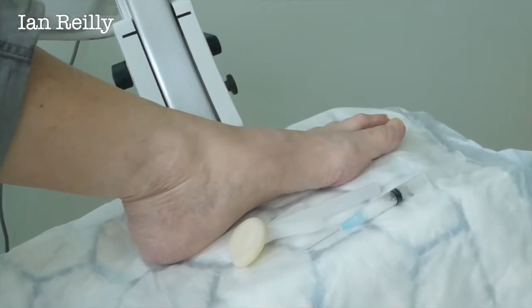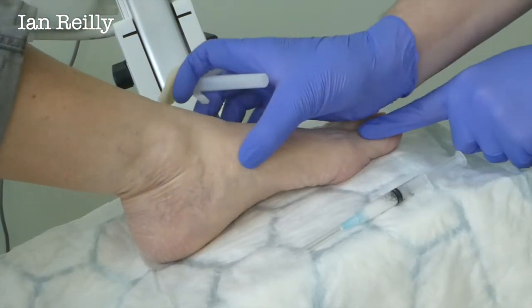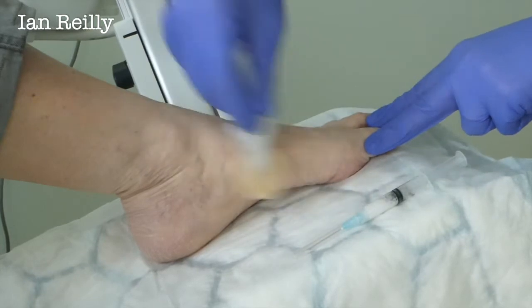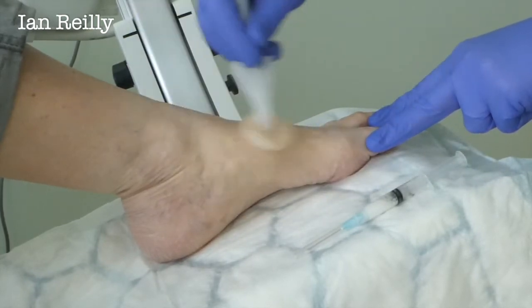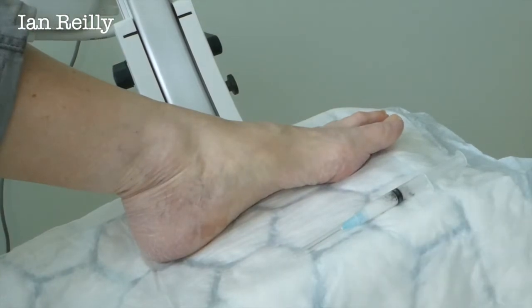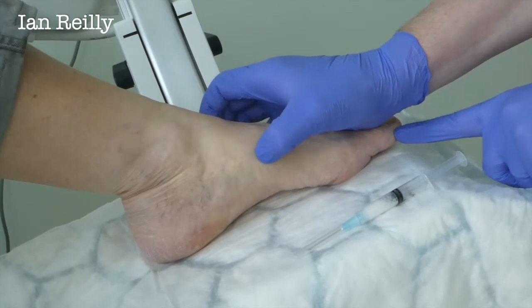So we'll start the video now. The first thing I'm going to do, Kathleen, is give you a little bit of a skin prep. You're sore on this side here, aren't you? Have you had any cortisone injections before at any point? Never had a cortisone shot — so first time. Okay, so this is the sore spot here.